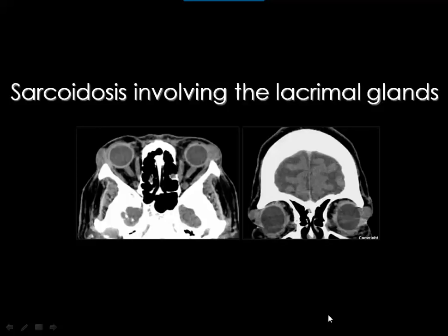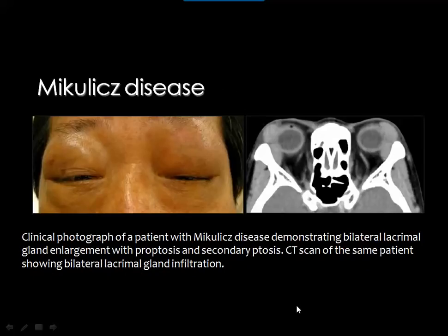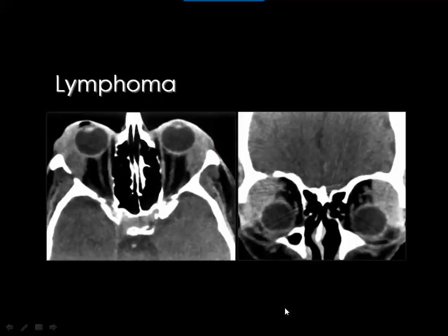Here is a case of proved sarcoid involvement of the lacrimal glands: both left and right lacrimal glands are almost symmetrically enlarged with homogenous post-contrast enhancement. A known case of Sjögren's syndrome shows the left lacrimal gland more enlarged than the right, both with homogenous enhancement. Mikulicz's disease shows bilateral almost symmetrical involvement with homogenous enhancement. Lymphoma can also affect both lacrimal glands bilaterally with enlargement and homogenous enhancement, and bilateral almost symmetric proptosis is appreciable.